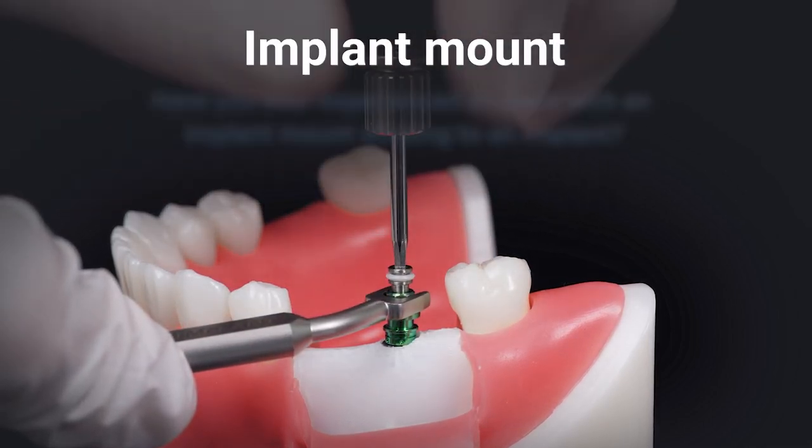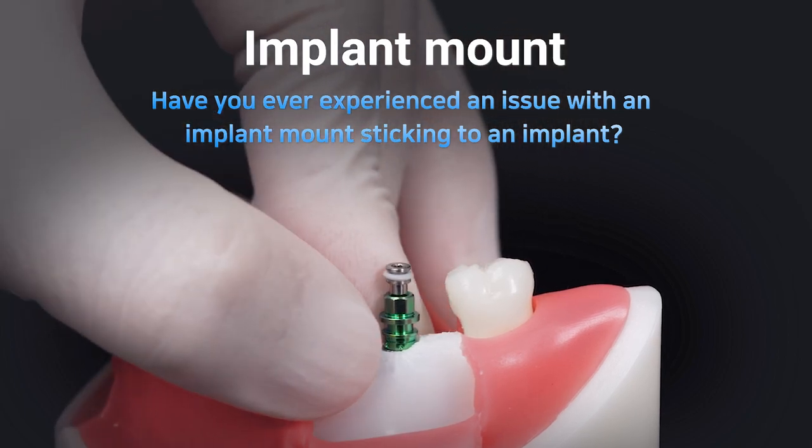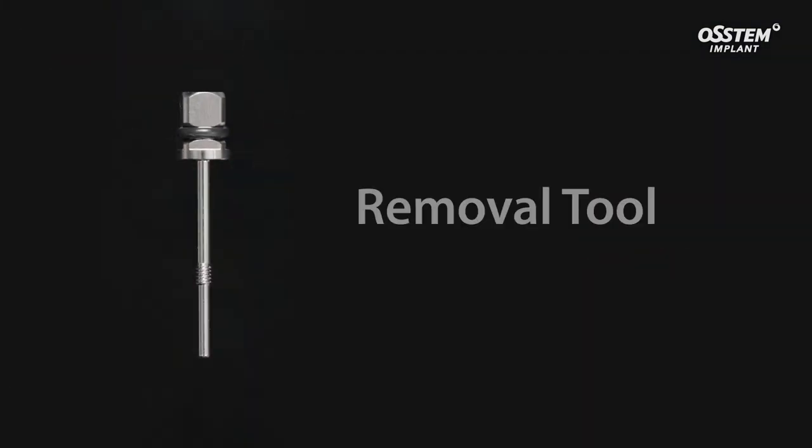Have you ever experienced an issue with an implant mount sticking to an implant? OSTEM Implant has a right solution for you. To remove the jammed mount from the implant, use the removal tool to easily remove the mount.